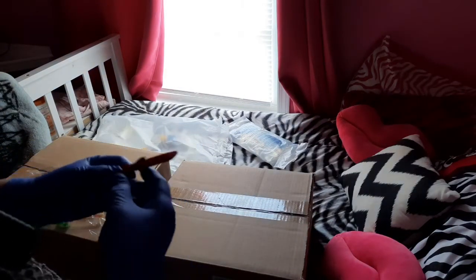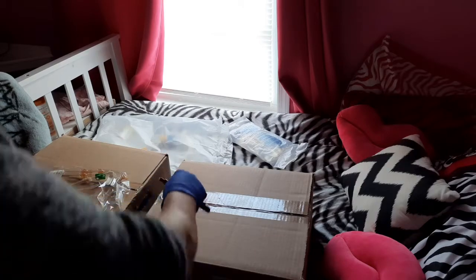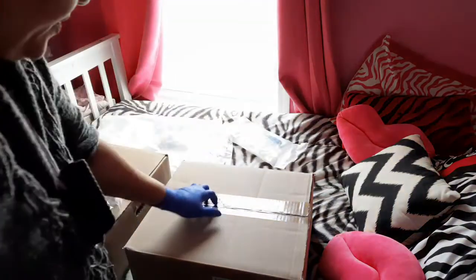We're going to go ahead and open up our 5-liter dialysate bag. Let me open up the box.